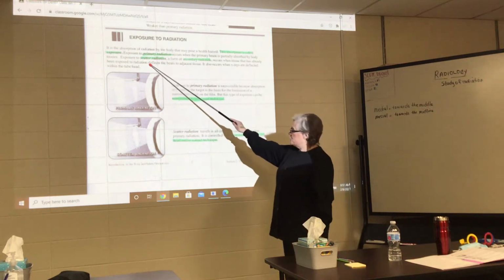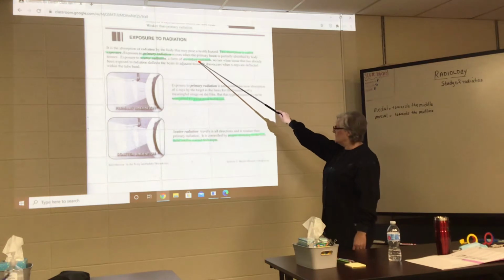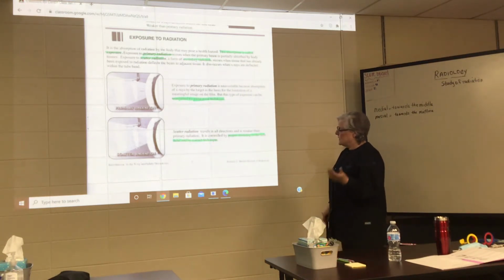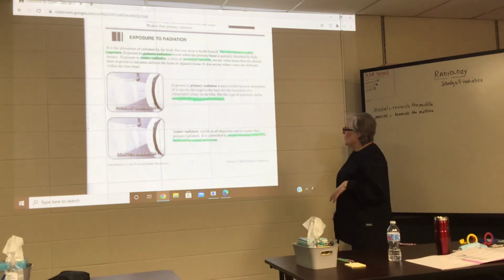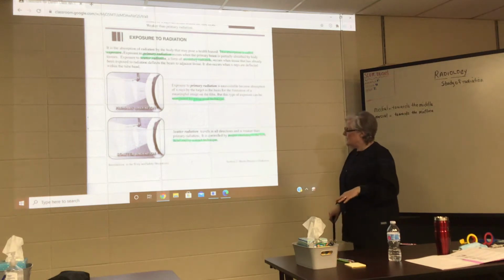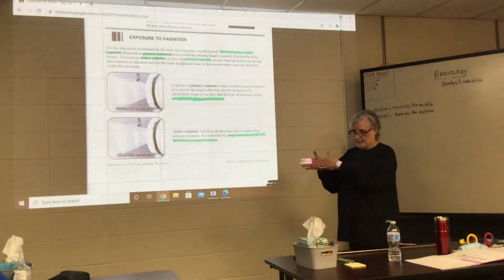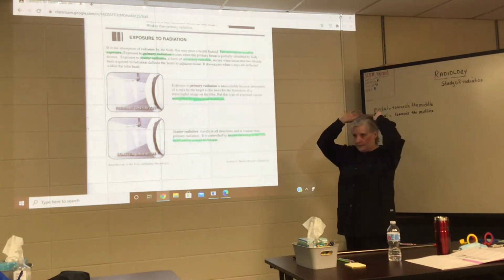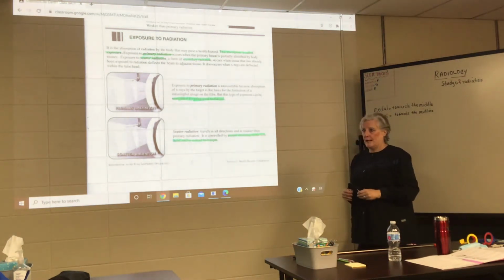Okay? Exposure to scatter radiation, a form of secondary radiation, occurs when tissue that has already been exposed to radiation deflects the beam to an adjacent tissue. It also occurs when X-rays are deflected within the tube head. If not for collimation in that PID, scatter radiation would be the result. Okay, do you understand the difference between primary radiation and scatter radiation? Yes. Leslie, you got it?